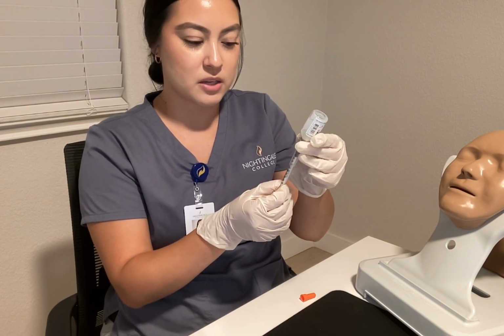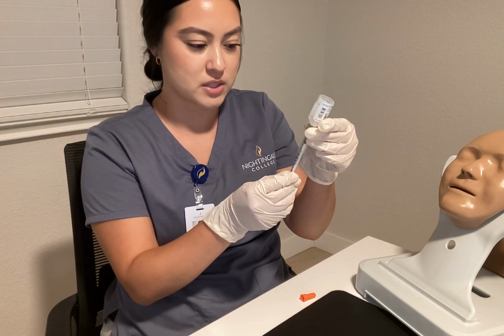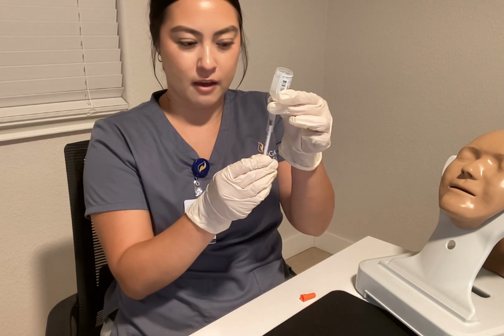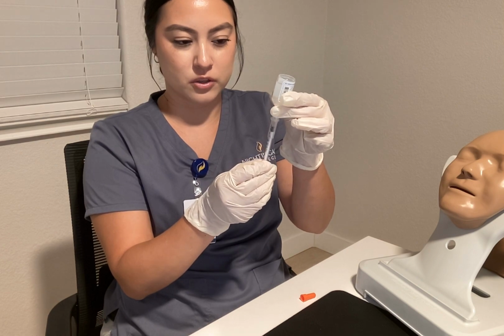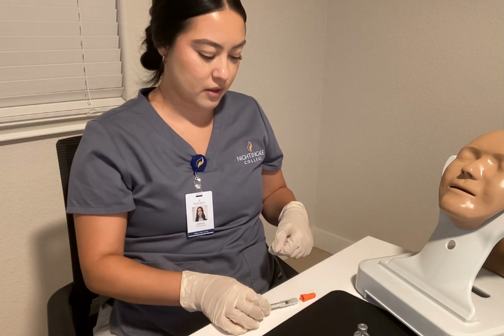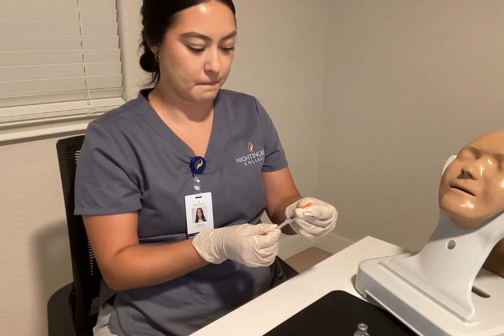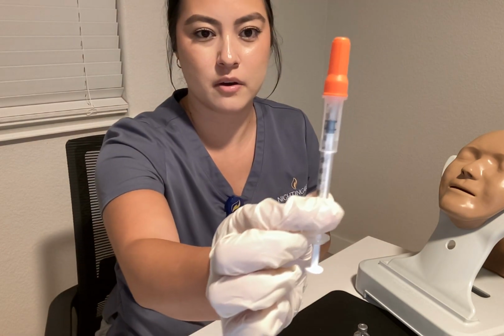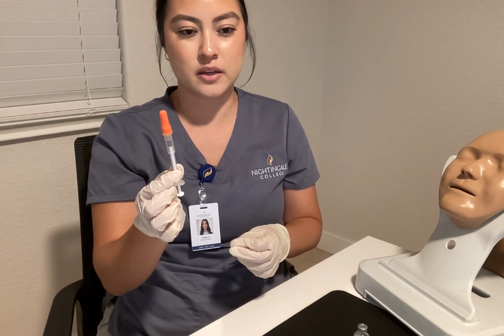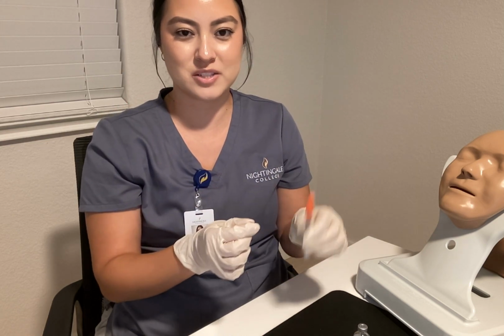So with a fast-acting, we're going to be drawing up 8. And again, for a total of 12 units that we are going to be drawing up. Again, I have my nurse verifying that this is 12 units in total. And we're going to do the scoop method. Okay, so now that we have our insulin here, again, we're going to double check with our nurse here, and we will go ahead and inject our patient.